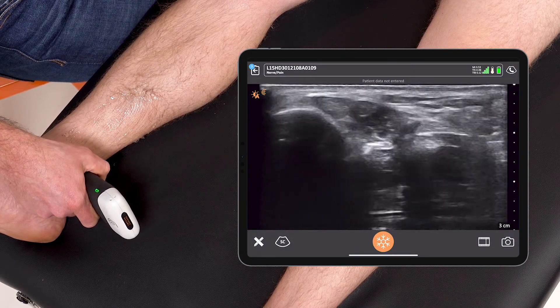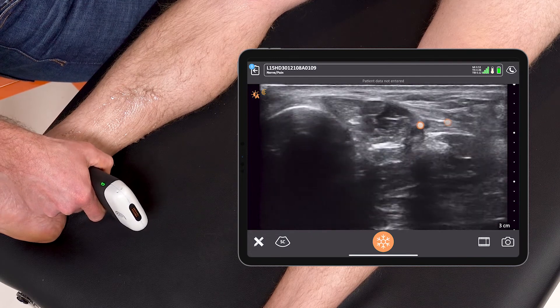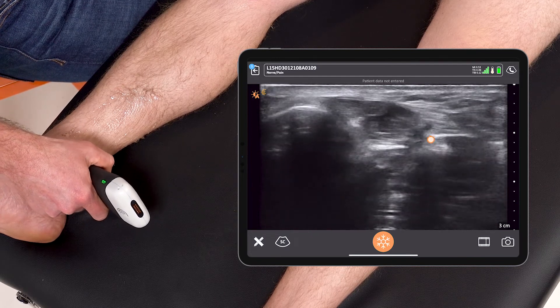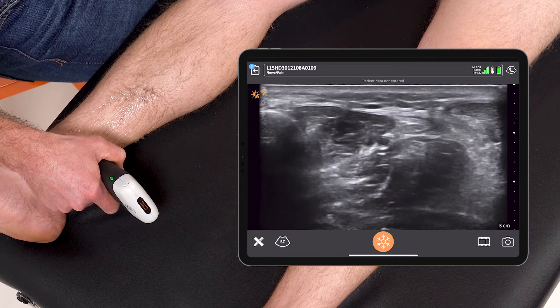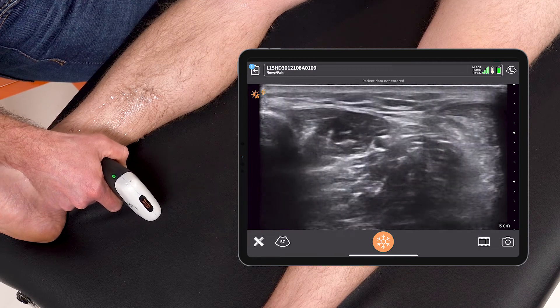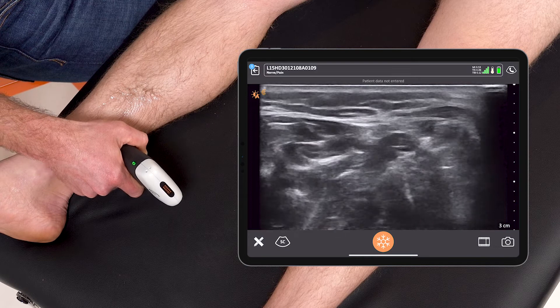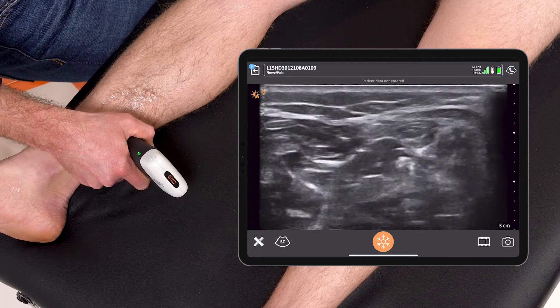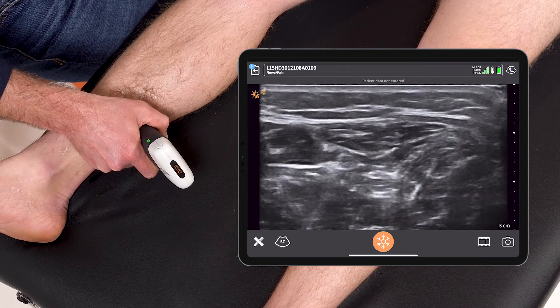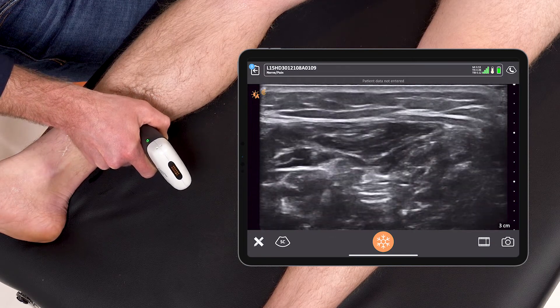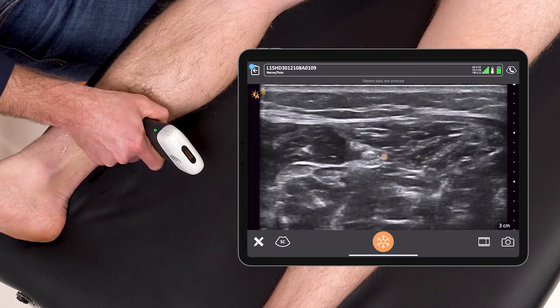I'll identify the posterior tibial artery here, and just next to it is the nerve. I can follow that structure proximal up the leg, keeping the nerve in view to find the ideal location where I feel best about doing my nerve block.